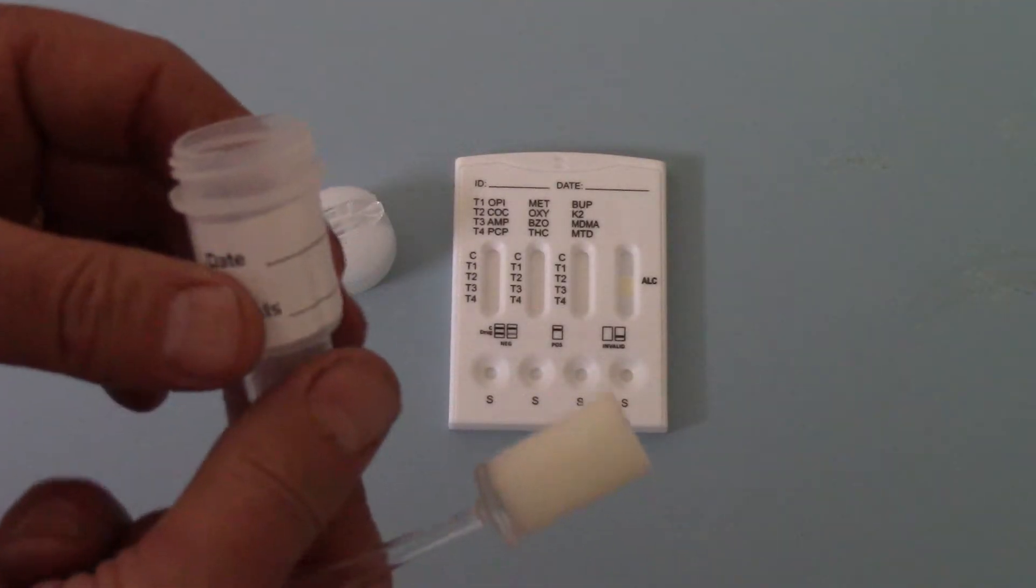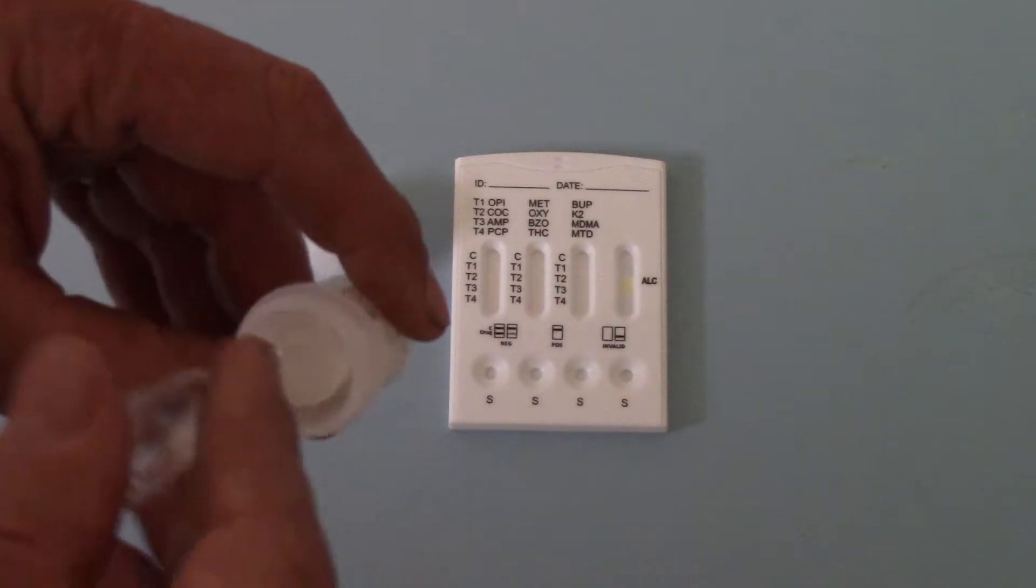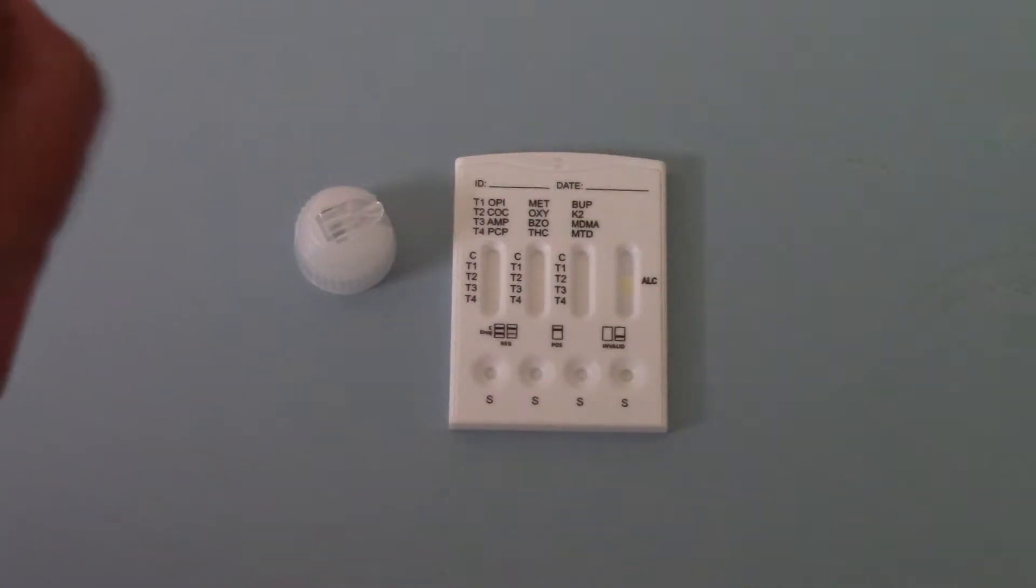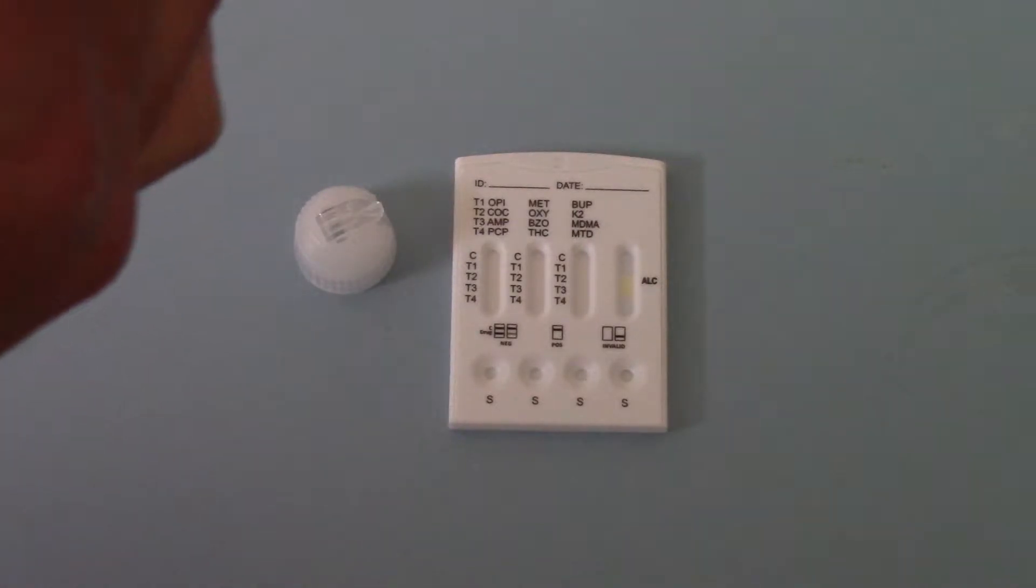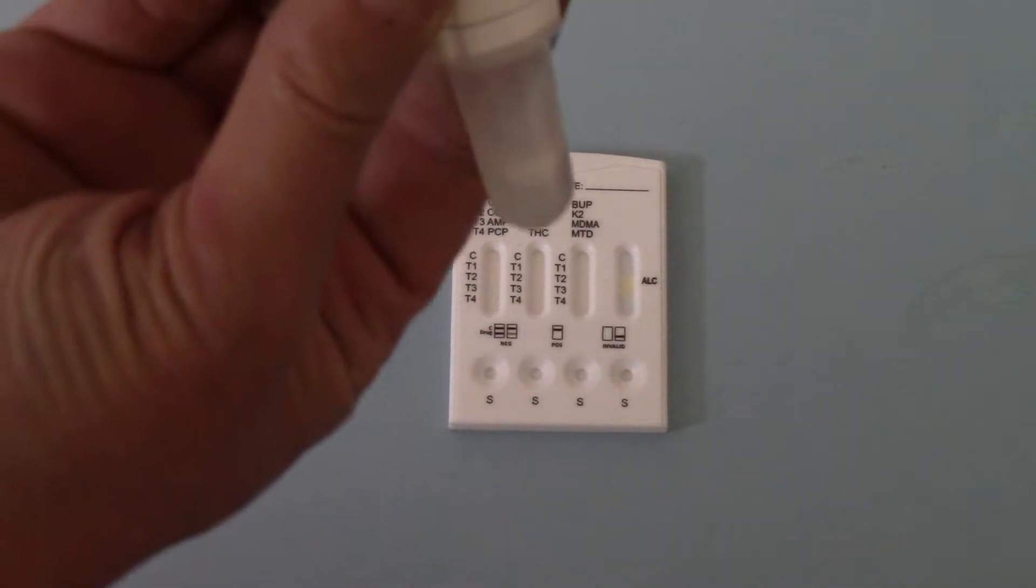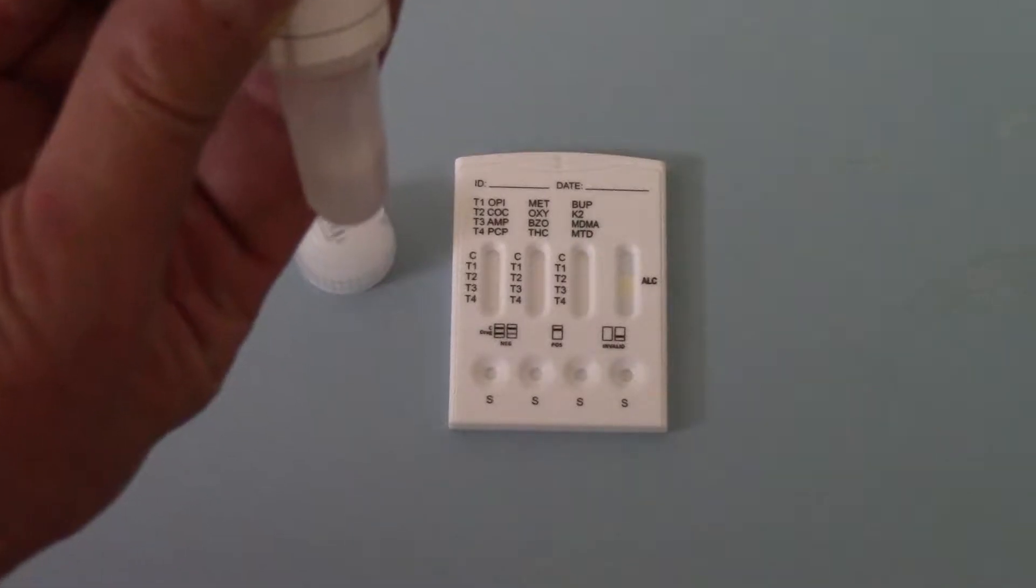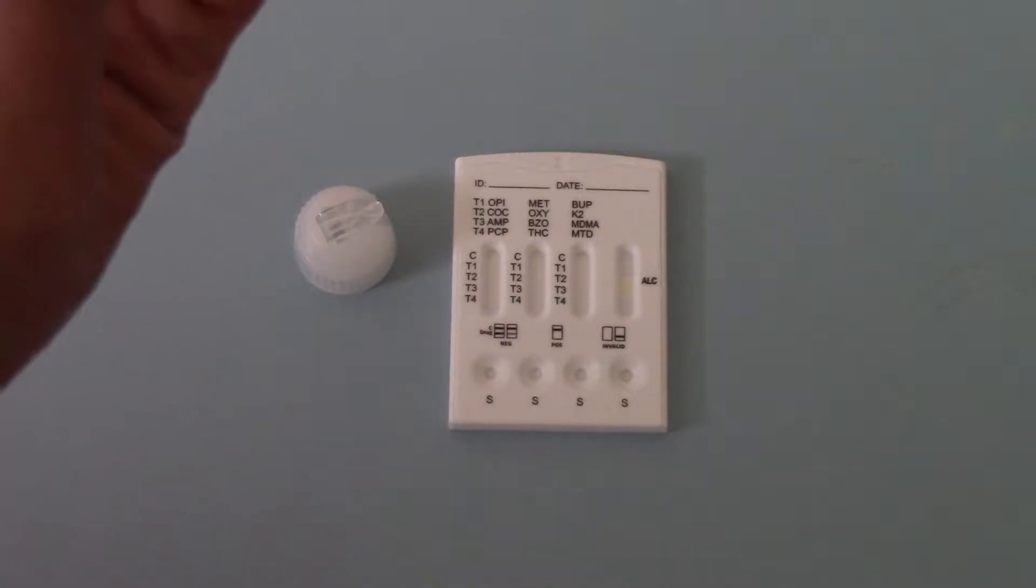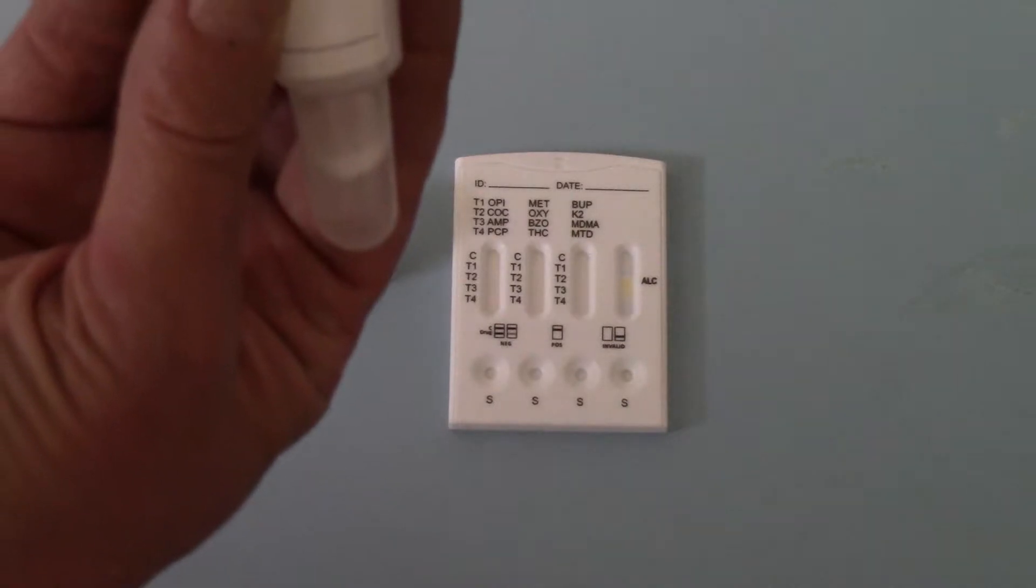Now if you unscrew the lid of the collector, you just push this down into the base and you'll see in the base we've got approximately five mils of saliva. When it's completely filled, that's a very good sample we've got there.